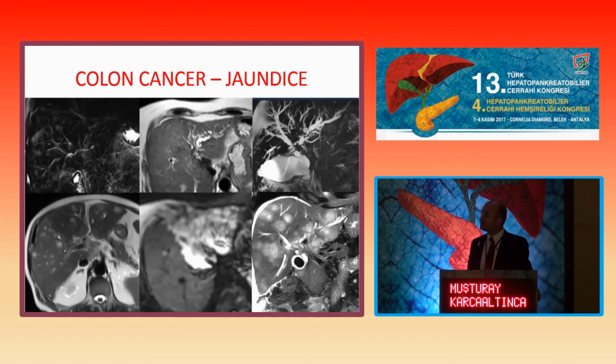actually. And also in this patient with a complex tumor in the Klatskin area, we can show that there are many areas of involvement, and also the left portal vein is occluded. So we obtain whatever information we can obtain in these patients by giving contrast.